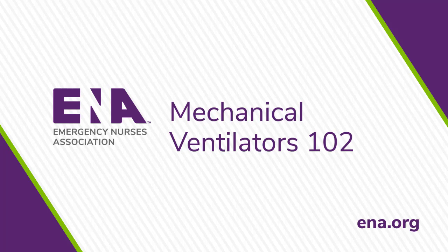Now that you have some understanding of the different modes, let's talk about ventilator settings. There are 5 basic ventilator settings that you should know: tidal volume, respiratory rate, positive end expiratory pressure, or PEEP, fraction of inspired oxygen, or FiO2, and flow rate. These are the vent settings determined by the physician or advanced practice provider that your respiratory therapist sets. This is important information to know, especially for handoff to the ICU. In most cases, all vented patients require an ICU admission. Let's break down the ventilator settings.